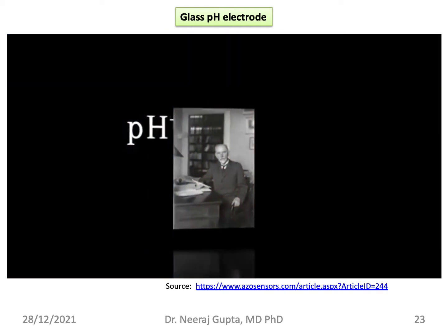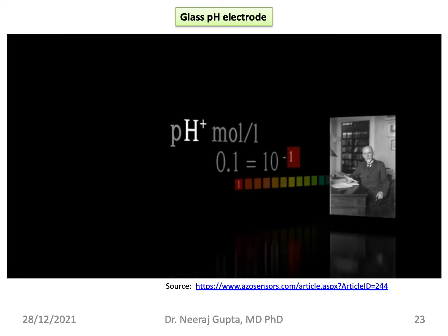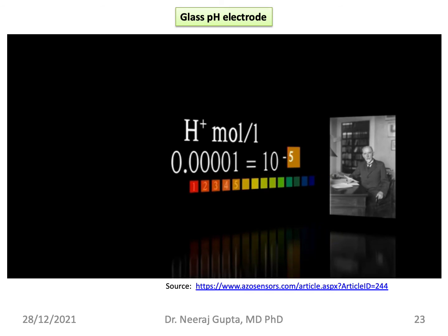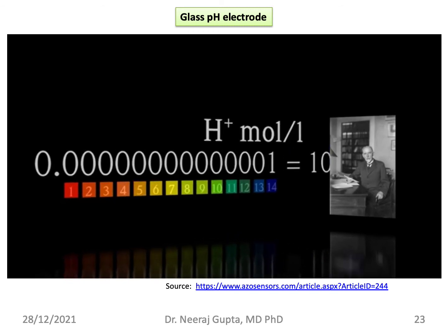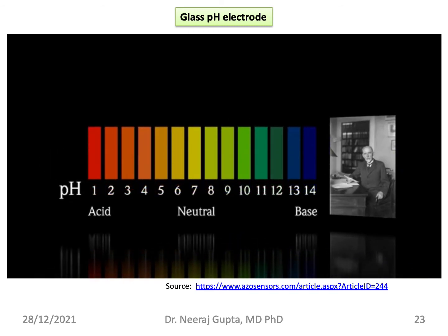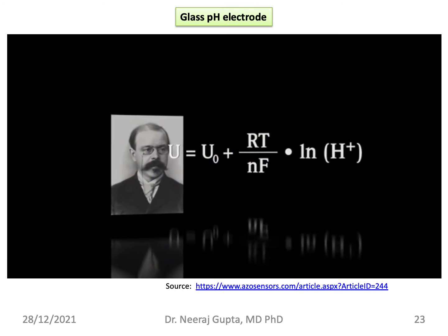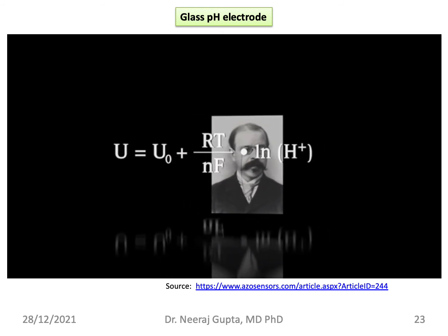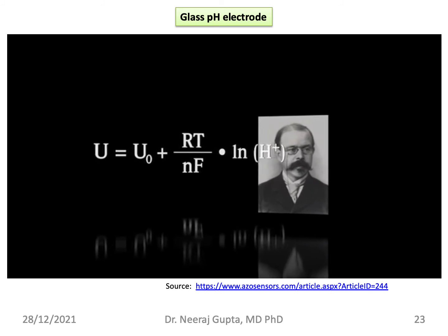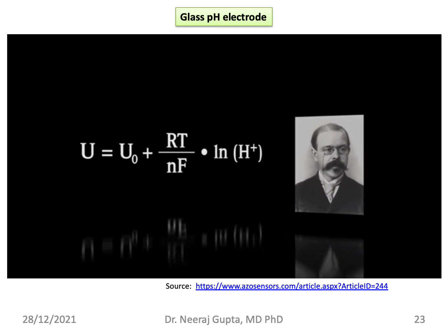The principle can be traced back to 1909, when the Danish chemist Søren Sørensen introduced the so-called hydrogen ion exponent, pH, to describe the concentration of hydrogen ions in a solution. This was the basis for the development of the conventional pH scale. In 1889, Walter Nernst formulated the Nernst equation that for the first time related electrical voltage to ion concentration. The Nernst equation derived for pH is the physical basis for pH measurement according to the potentiometric principle.